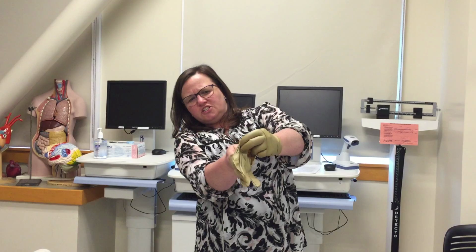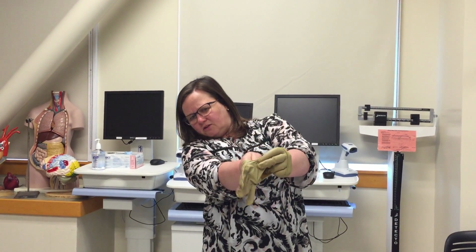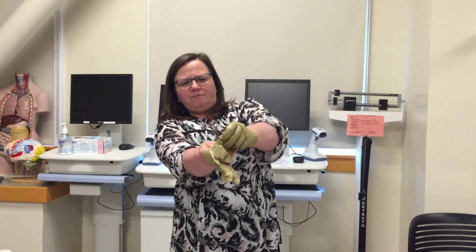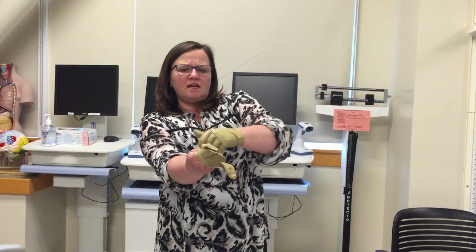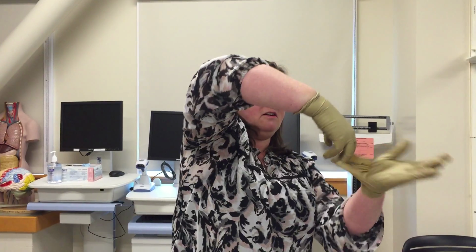You don't want them to touch your skin. So if you hold your hand straight up, sometimes they fold in half and they touch your skin, so I'm going to pay attention to that. I'm going to keep this thumb out. I'm having a little bit more trouble, but that's okay. Once this is like this, I can now take my fingers here to pull that cuff down. Yours may not have quite as long of a cuff.